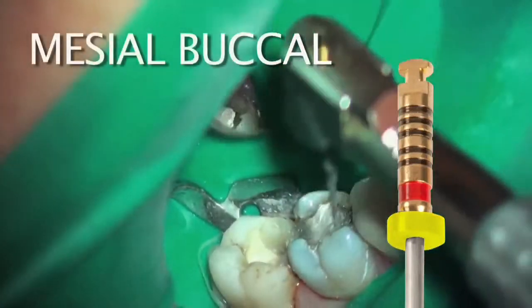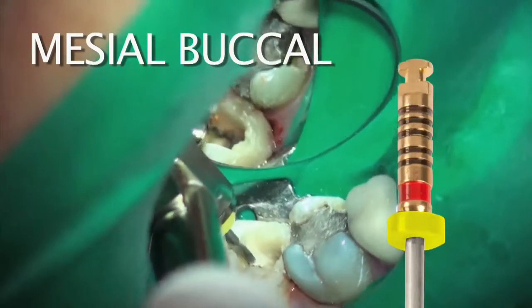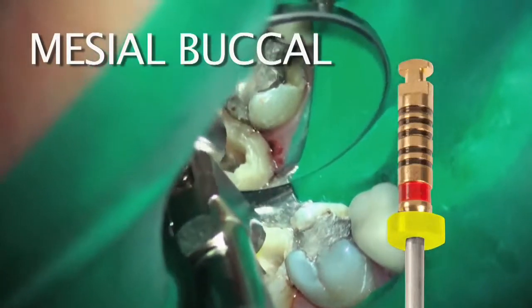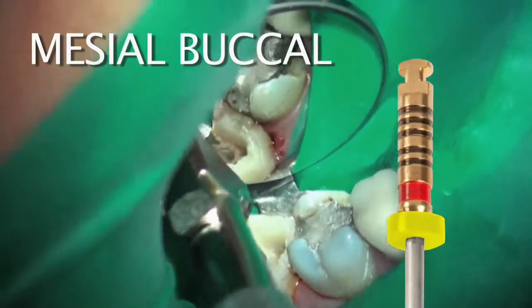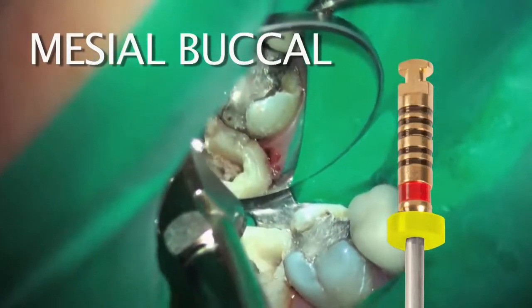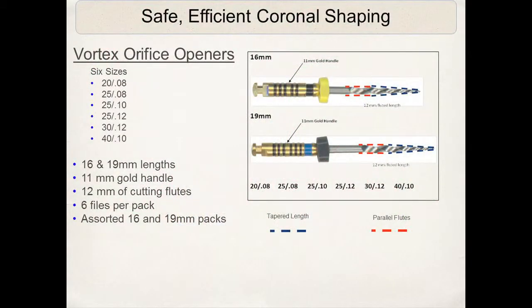Orifice openers are only applied to the orifice — to the coronal one-third of the canal — and are not meant to go around acute curves. In fact, if you encounter a case where there is an acute curvature directly below the orifice or within two or three millimeters of it, I would suggest not using these orifice openers. These are stiff, robust files. I would rather open those up with hand files and path files.